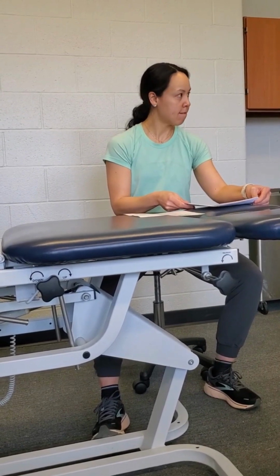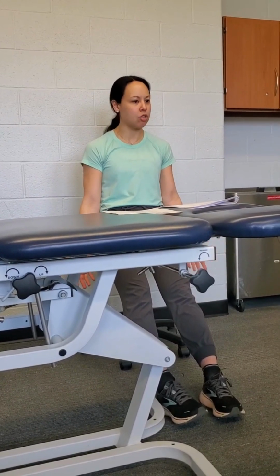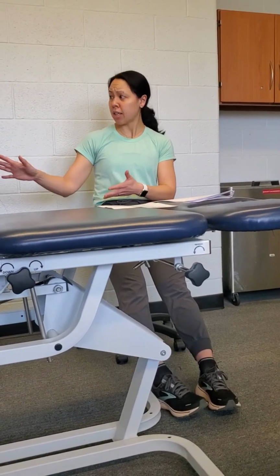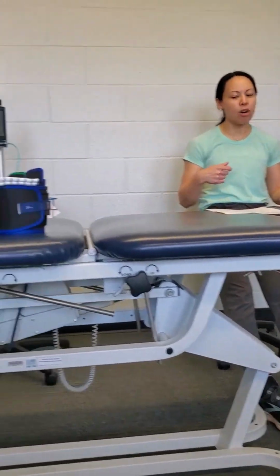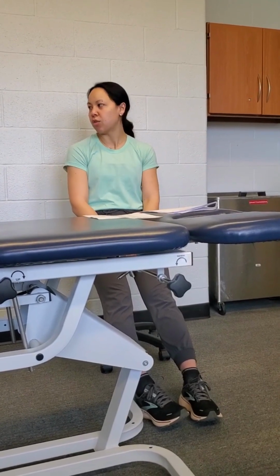Did you mention if that was done in the position of the exercise? No. So regardless of what exercise they're going to do, they have to lie down and just completely relax. They shouldn't be talking. They shouldn't be doing anything. And that's when you would hit the blue button. That's the first thing you're going to do, calculate the Doppler. Once that is calculated and there's no error codes, sometimes that can happen if the cuff isn't on properly or the patient was moving, and we'll talk about strategies to get around that. But yeah, you certainly do that. Once it's calculated, then they can get up, move to a machine, move to just a seated position, standing, whatever you want them to do for the exercise after that.